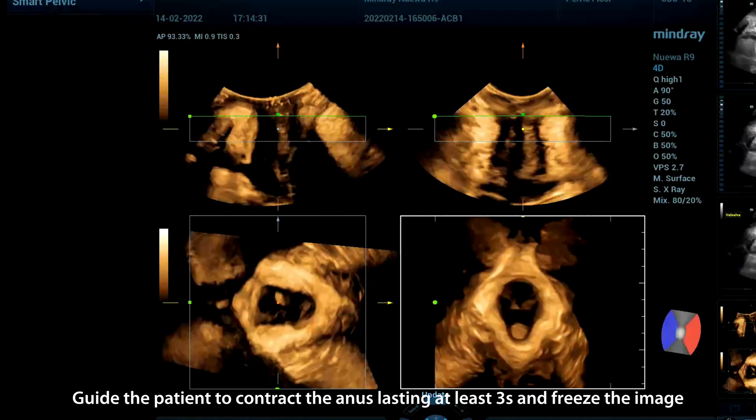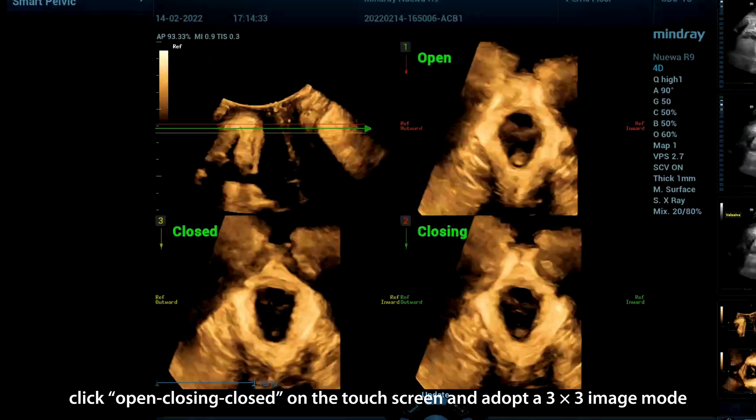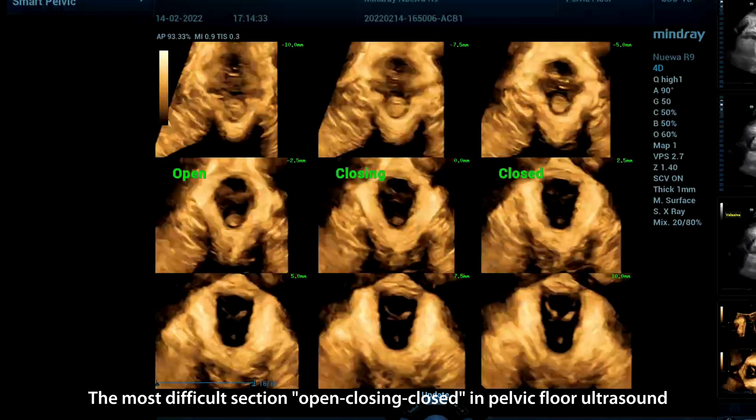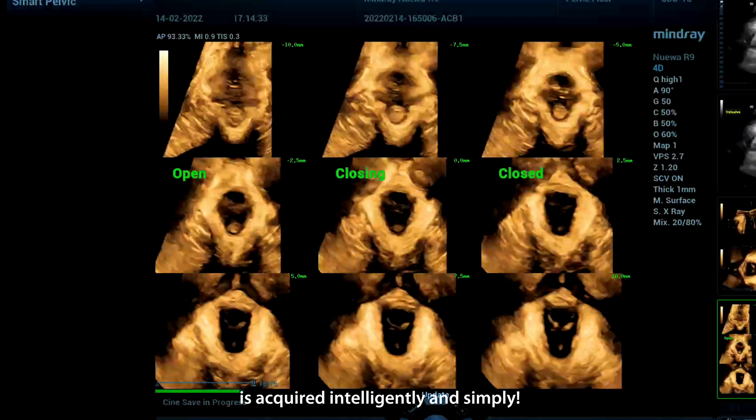Guide the patient to contract the anus lasting at least 3 seconds and freeze the image. Click Open/Closing/Closed on the touchscreen and adopt a 3x3 image mode. The most difficult Open/Closing/Closed section in pelvic floor ultrasound is acquired intelligently and simply.